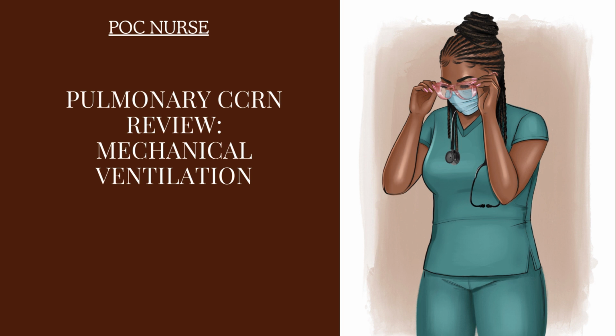Next, we're going to talk about synchronized intermittent mandatory ventilation mode. That is the SIMV mode. SIMV mode can be used for weaning the patient off the ventilator. Why? Because the ventilator will allow the patient to trigger a breath and pull the amount of volume of air that they can pull on their own without providing any volume support.